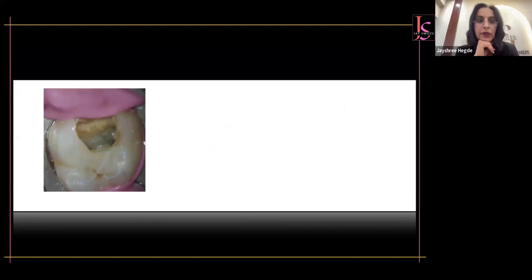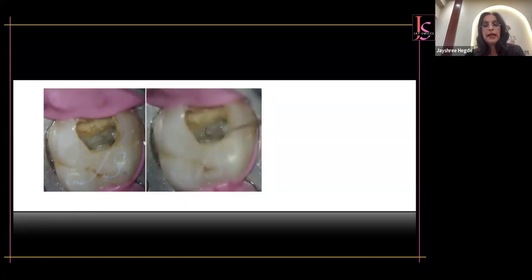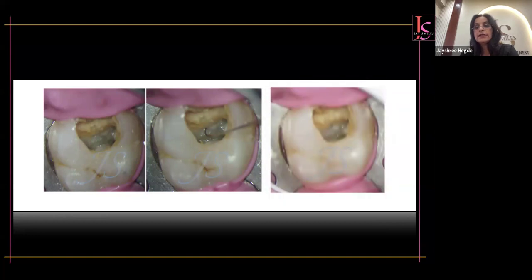So this is an image where you can see that I have opened a tooth for root canal treatment. I've done an access opening, and I've found the three canals. First thing you need to do is find the easier one. Clear your chamber nicely. You can use ultrasonics to clear the chamber. You can also use your slow speed burs. And then you can see where exactly I have used my number 10 K file. That's exactly where your MB2 is. And we enlarged it. So this figure is not so clear, but that's how we have enlarged the MB2.